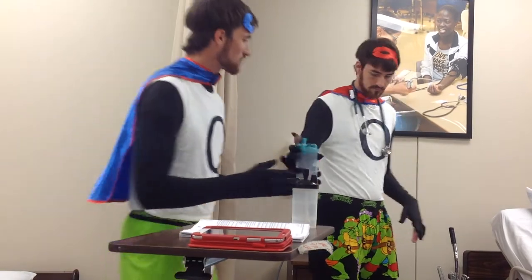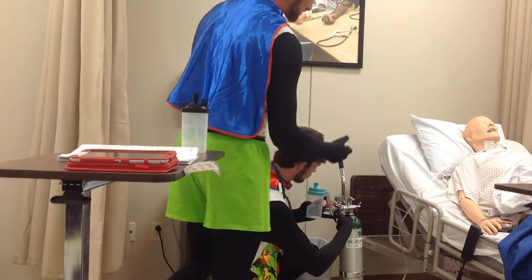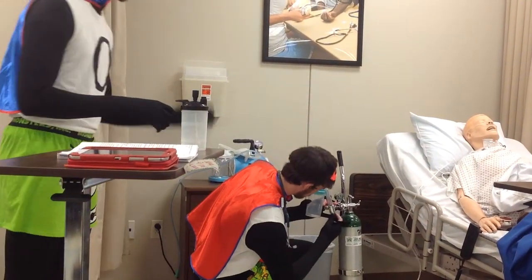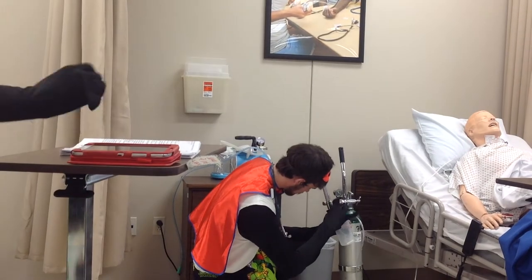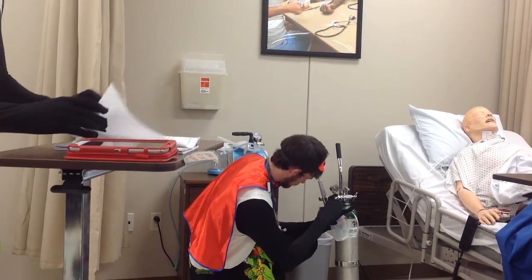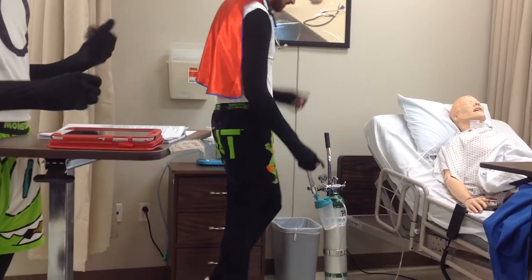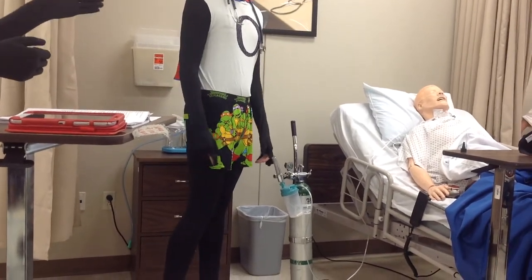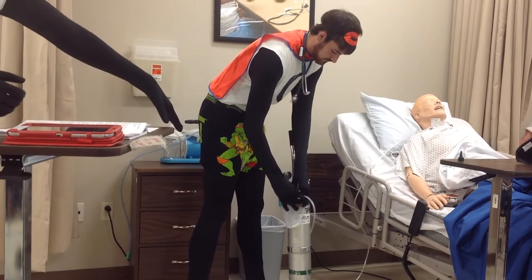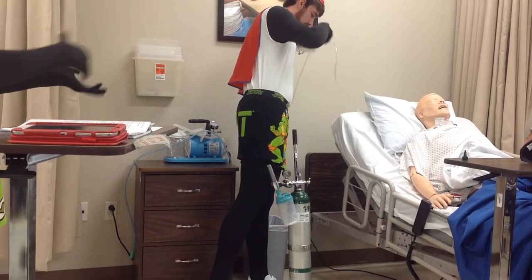It's real simple. Of course, you want to put it on the regulator that we're specifying, the more complex one. It simply screws on, and then you attach the hose to the other end, and it's just like connecting the pipes. So I'll just pass that through. And after you've done that, make sure it starts bubbling. Once you have it on, to know that it's actually working, the water will start to bubble, showing that the air is there. And if there's water collecting somewhere, maybe at the bottom of the hose, the simple way to get rid of that is to take off the cannula and pour it into the trash can.